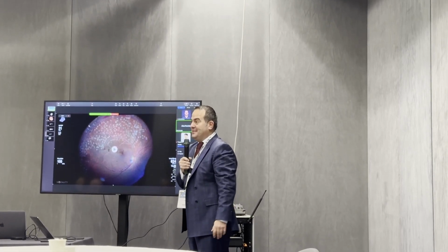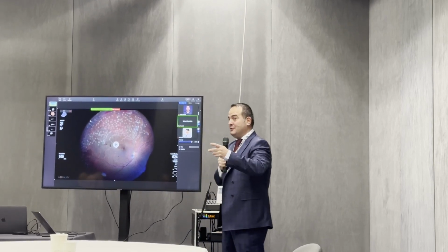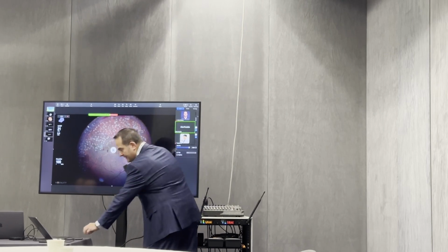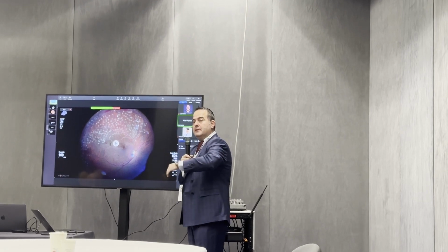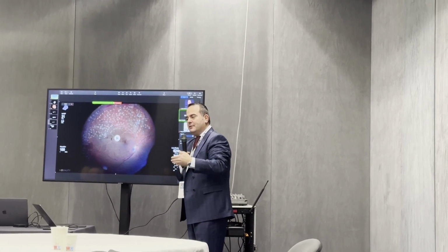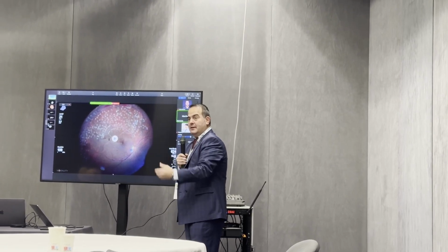I don't really know. I mean, it's hard to say, obviously. Dr. Riemann has more experience than me. And there is a lot of logic in what you said about the venous arterial recirculation, probably refilling. But flipping the filters is something that I regularly do, because I have more than 10. And sometimes you see something that you didn't really think about. I mean, this filter is not created for this particular condition, but you can see a lot of things sometimes.